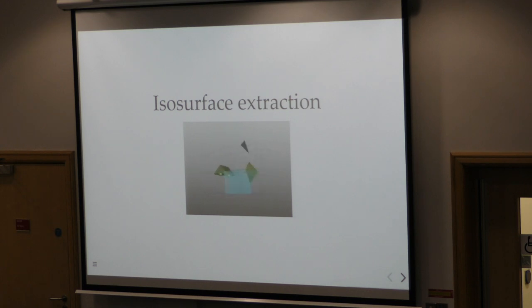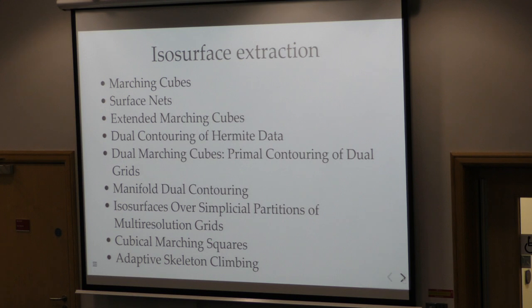There are actually quite a few different algorithms you can use to approach this task, and you might wonder, if everything we've done before was about ensuring accuracy, what difference does it make which algorithm we use here? Ultimately it produces the same highly accurate model, but while accuracy, in terms of how it relates to the actual physical shape described in the images, is the main factor we're concerned with, there are also things to factor in, like the file size as dictated by the number of faces. There's potential to describe an accurate version of that same shape with fewer or more faces depending on how you've accomplished that reconstruction.